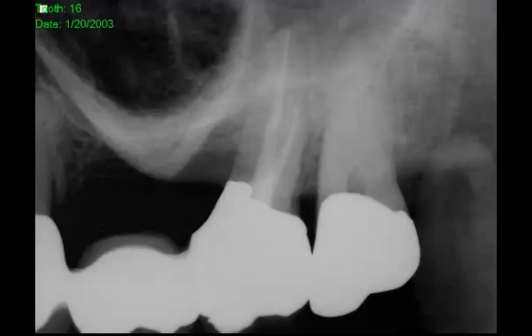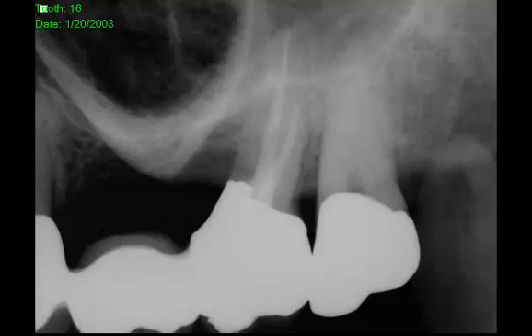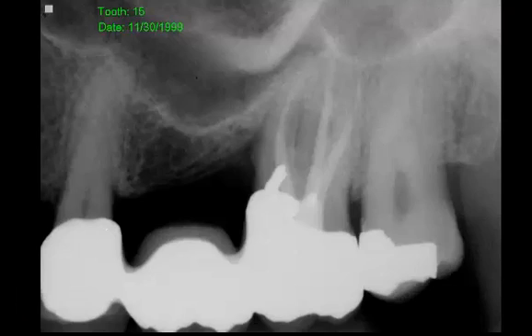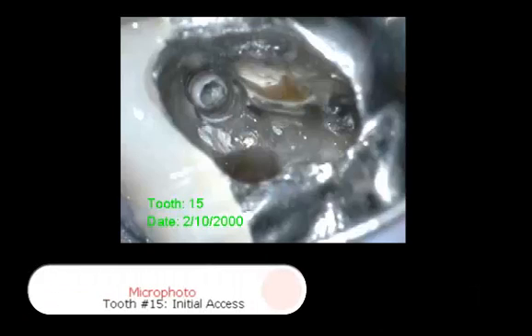This is a case that I treated in 2003. It was a wisdom tooth, which I rarely treat, because these types of teeth rarely have strategic value and a need for treatment. But in this case, the patient had a long-span bridge with the distal abutment, having had a mesial buccal root amputation and previous endodontics, which I had performed in 1999.